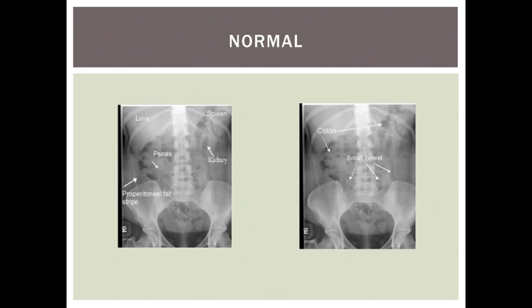The labelled examples of normal x-rays show you the position of most of the intra-abdominal structures. You can see air within the bowel which shows up black, with denser structures such as the liver and bones showing up white. It is important to remember how much bone can be seen on abdominal x-rays, as it is not uncommon to diagnose a crush fracture of the vertebrae or a fractured neck of femur unexpectedly on an abdominal film.